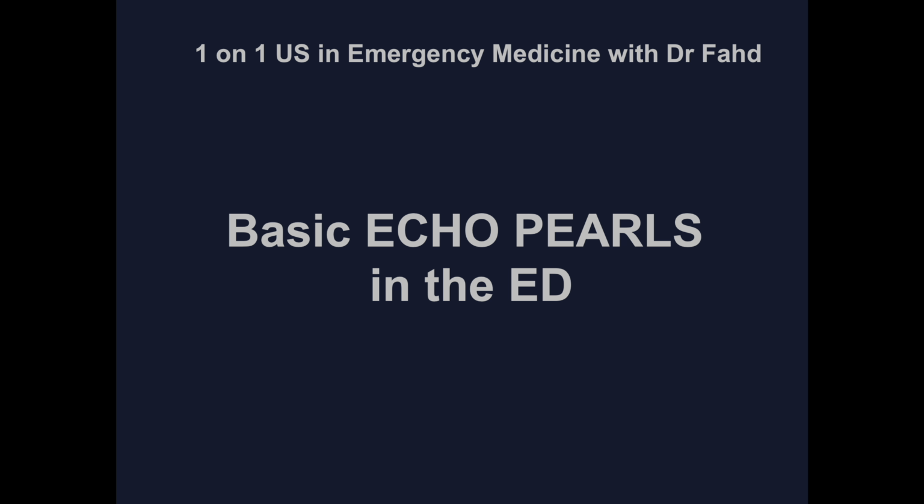In today's video, I want to cover the basics of echocardiography for the emergency physicians. The aim is simple: to help you understand the core echo windows we use at the bedside and how to recognize them quickly and confidently in a real clinical situation. What we are not trying to do is to replace formal cardiology echo. This is focused point of care ultrasound. The goal is to assess cardiac structure and function rapidly, especially in the unstable patient.